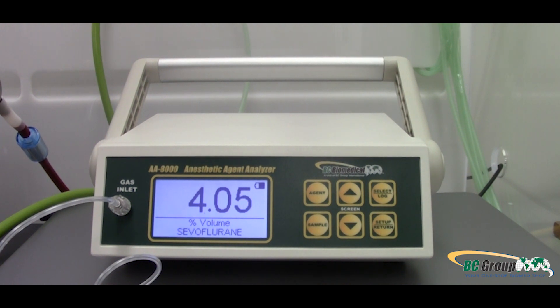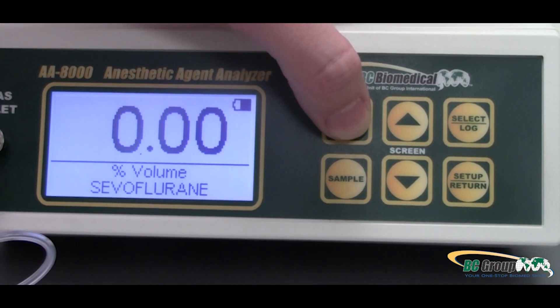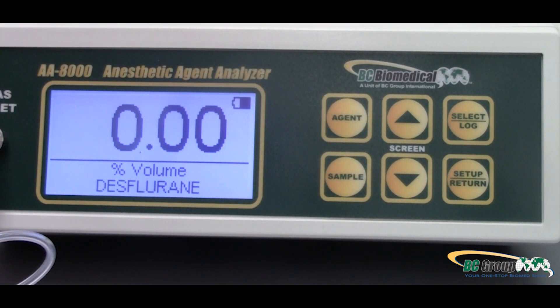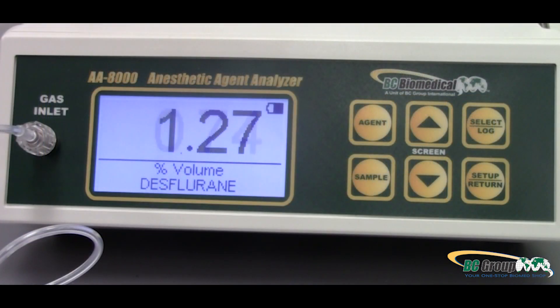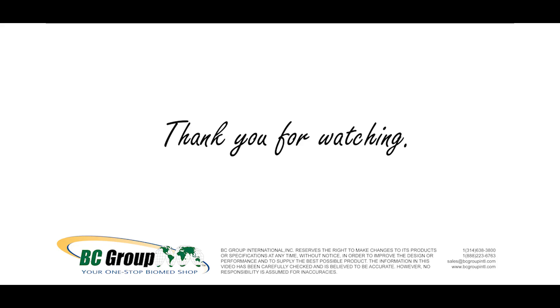The AA8000 makes switching agents easy. Simply press agent to cycle through to desflurane to display your reading. The AA8000 also compensates for barometric pressure.